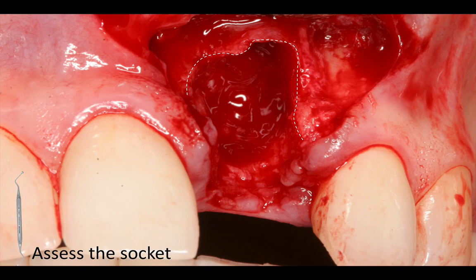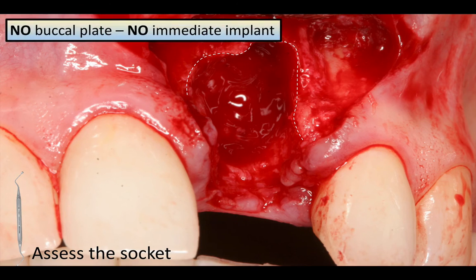So once it's all clean, I like to count the number of walls, and in this socket, we have an intact palatal plate. We had mesial and distal, but the buccal plate was very severely compromised and was quite wide. So my rule of thumb is no buccal plate, no immediate implant.